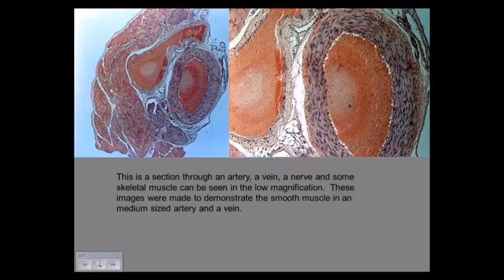So this over here is skeletal muscle. Okay? So you've got arteries and veins going through skeletal muscle. Check. What do you think these are? Those are cross-sections of nerves. Arteries, veins, and nerves travel in the same area. It's like how you wire a house. Well, your wiring follows the plumbing. Okay? And sometimes the wiring follows the conduits of your heating system. Okay? Makes it easier that way. And that's what's happening in you.